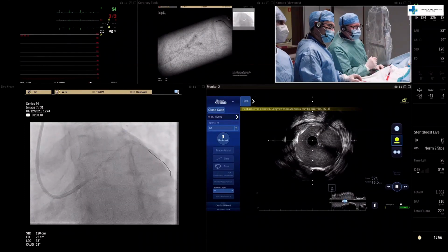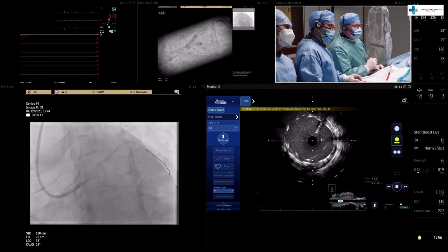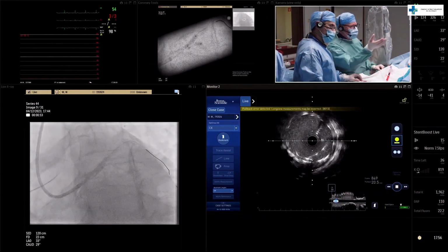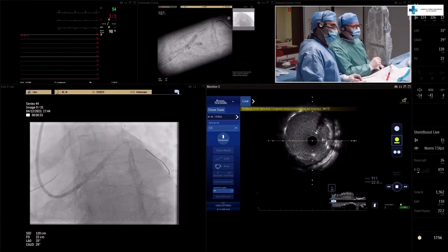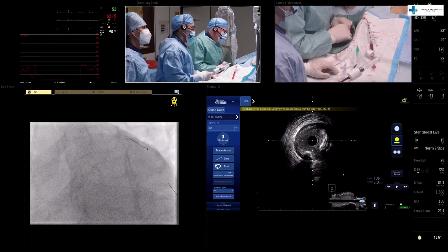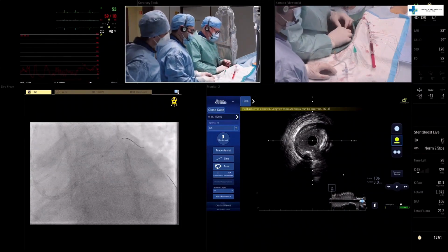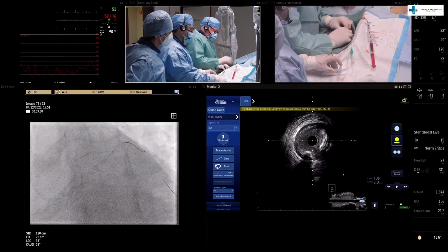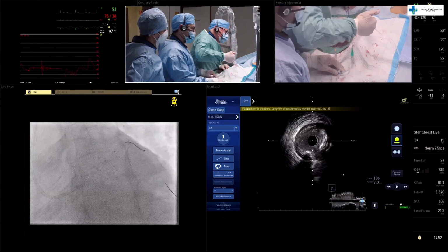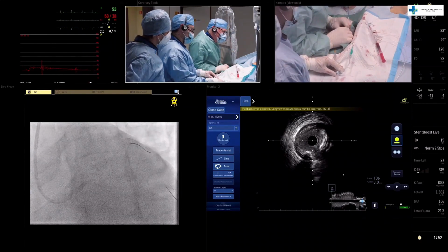We can see also the ostium of the, oh, you can see here this double layer. We have some, Pavel, probably this is some kind of stent distortion. My 3.5 balloon is parked in LAD, and I am going with 3.0 by 10 millimeter long DEB, paclitaxel eluting balloon, and I will try to position its distal marker at the carina level, Pavel, somewhere here and open.